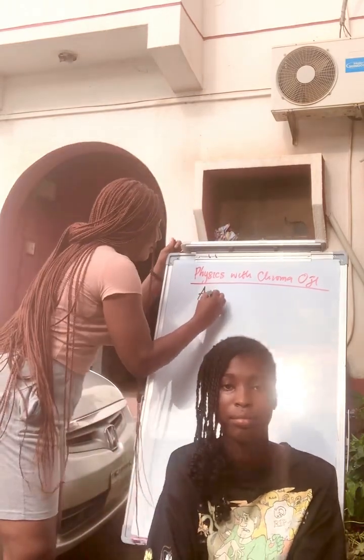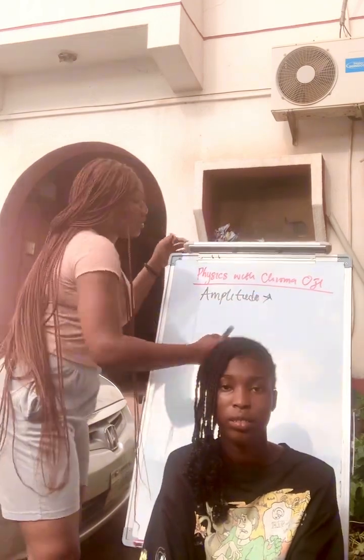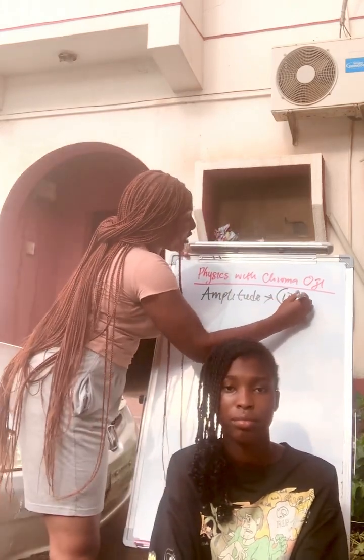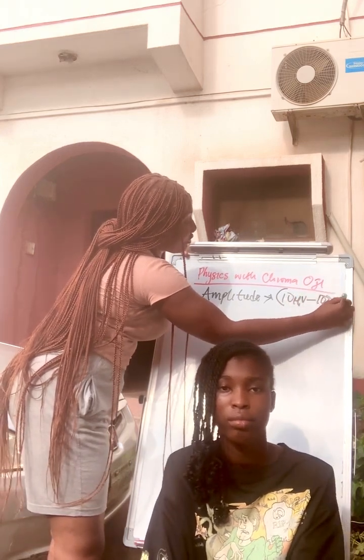You know, there's an instrument called the encephalography. It is used to measure the brain signals, the current in the brain. If you want to use this instrument, there are two things you have to consider. First of all, the amplitude. Because the amplitude of the brain is relatively small, we are looking at from 10 microvolts to 100 microvolts. Relatively small amplitude.